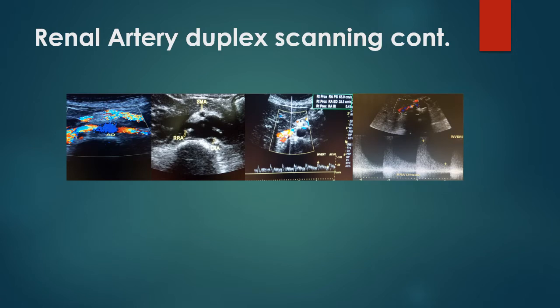In these images you can see the aorta at center with the right and left renal artery coming off the vessel. The second image shows the superior mesenteric artery in relation to the right and left renal artery. You can see the normal waveforms in a renal artery, with a resistive index less than 0.7. The last image shows high-grade stenosis at the right renal artery at the origin, with a velocity of about 600 centimeters per second.